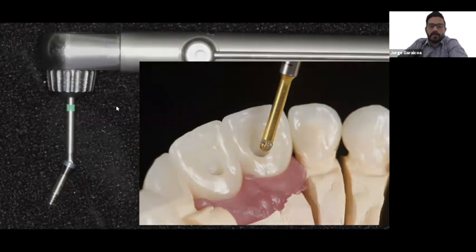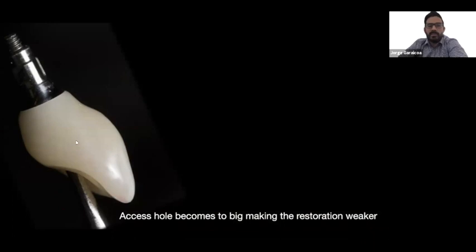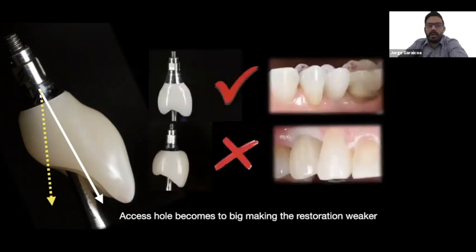They offer you up to 30 degrees, but what I see is that when you change the position, some degrees can be okay, but when you have very extreme degrees, you start having some issues. One of those issues is the thickness of the materials around the neck area. Because of that exaggerated angle, you are not able to keep the emergence profile. Remember that when we are doing our implant restorations, we want an emergence profile that facilitates the resting of the tissue right there. You want a concave shape, especially on the facial, where you want the tissue to rest. When you have these off-angle screw channels, this part starts to be too thick, and it will not allow you to do those contours that you want.